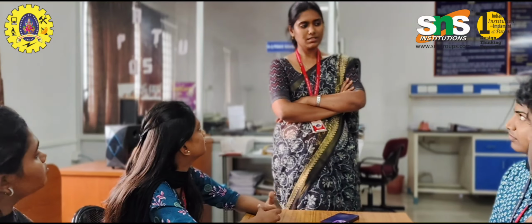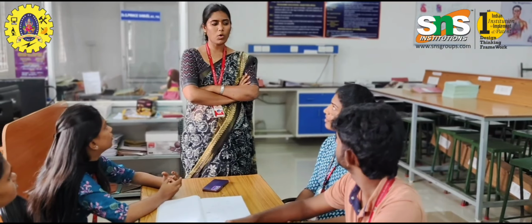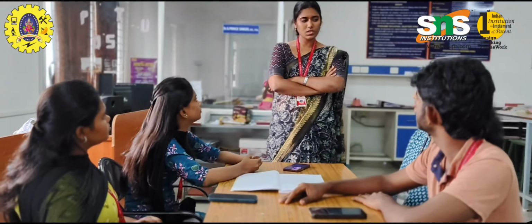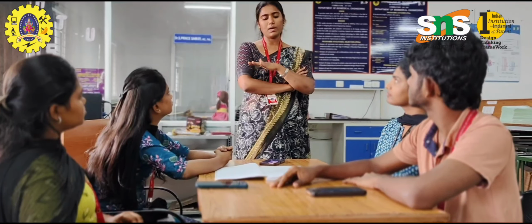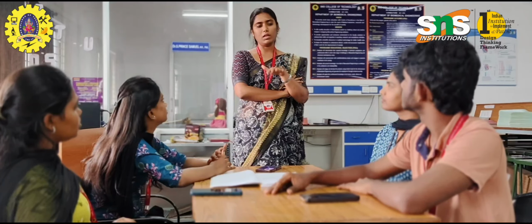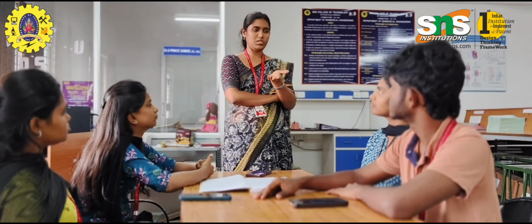And one more thing is, we should be aware of the electrical currents, make sure of leakage currents and electrical safety, and one more thing is proper maintenance and calibration of the medical device. Because the ESU is a machine dealing with high frequency current, there is a high tendency for the patient to get shock. So as a biomedical engineer, our role is very important, in order to improve the quality of life of the patient by ensuring patient safety.